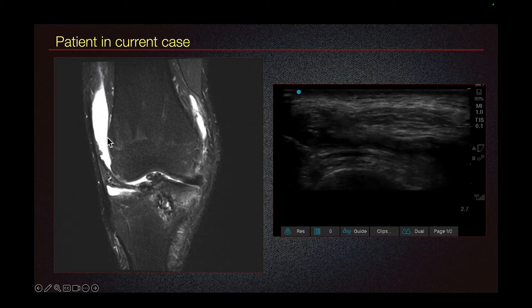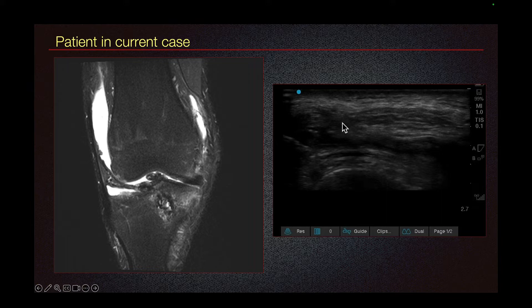Here we see a large knee joint effusion, and this ultrasound image also shows the knee joint effusion. This is the distal femur. These are fat, and this anechoic structure is the joint effusion.